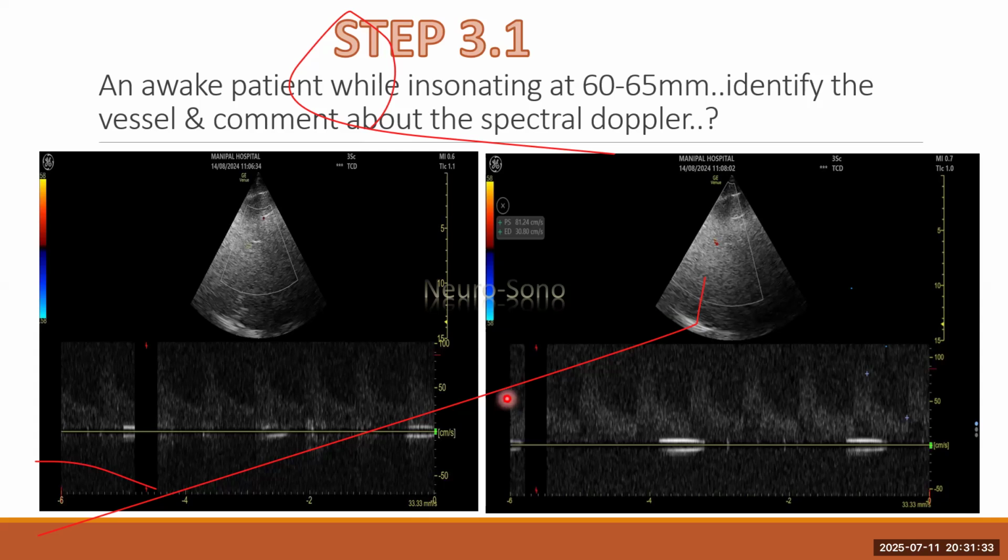This is ipsilateral MCA, which I am insonating, probably proximal and distal. What are the things which we do see here? This hyperechoic sort of vibrations which we see. Turbulence? Not turbulence per se. Turbulence would not start off in diastole. That's the main reason.